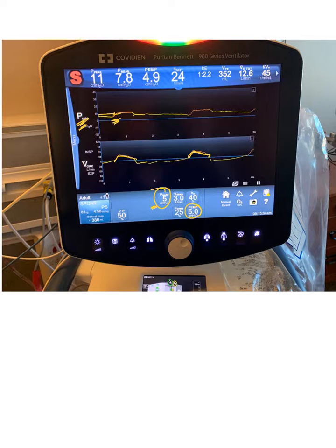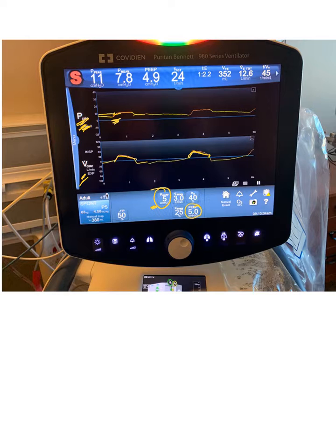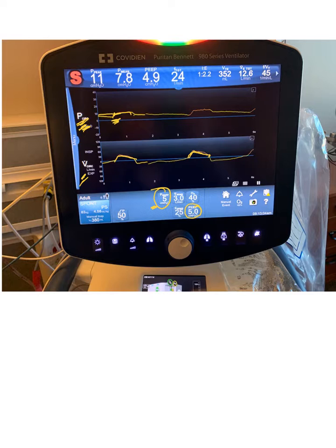By looking at the pressure waveform and the flow waveform together, you can tell which is the target. Look at every breath: if the flow is consistent, then it's a flow target. If the pressure is consistent, it's a pressure target. If the pressure is variable and not consistent, it's a flow target. If the flow is variable and not consistent, it's a pressure target.